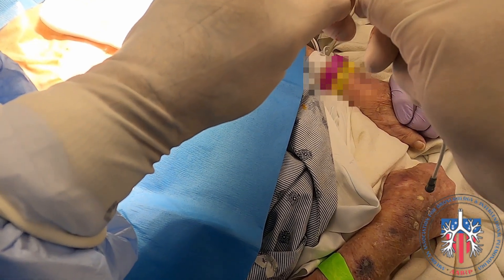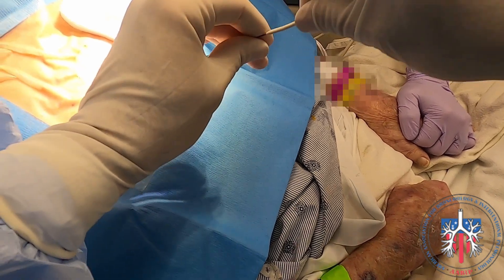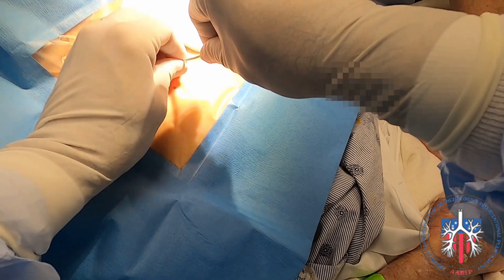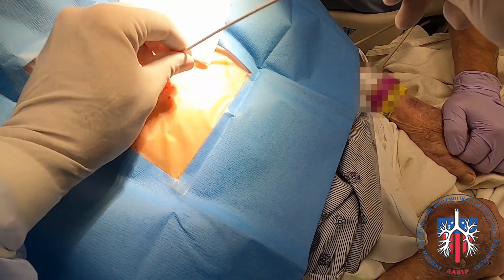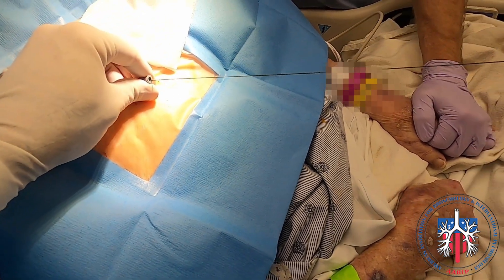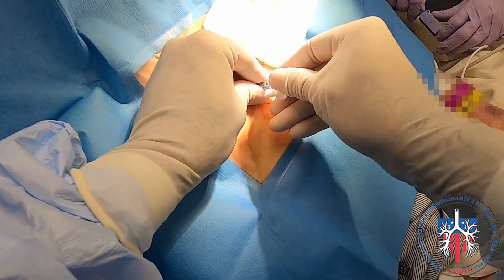The catheter is passed over the wire, making sure that the wire comes out on the other end of the drain before inserting it into the pleural cavity. Once the catheter is in, the wire is removed and a three-way stopcock is attached to the end of the catheter.